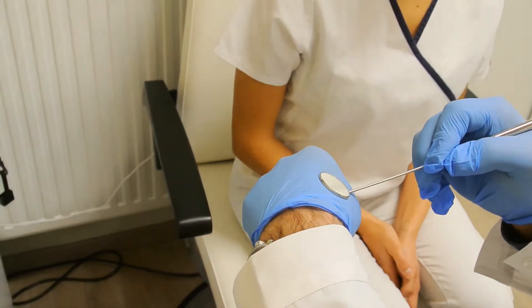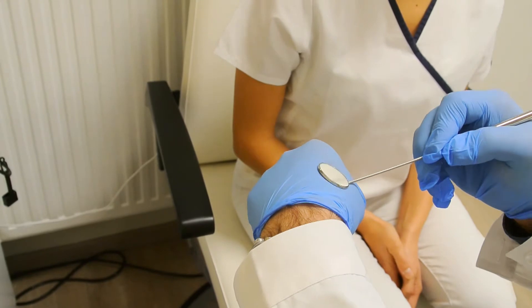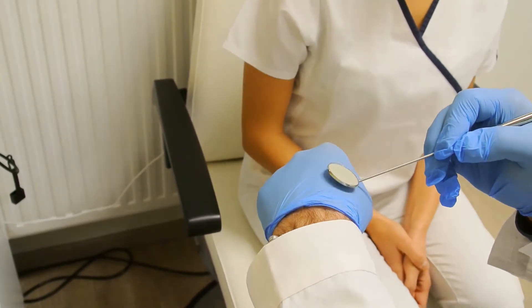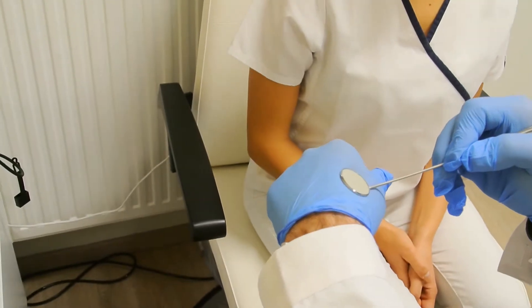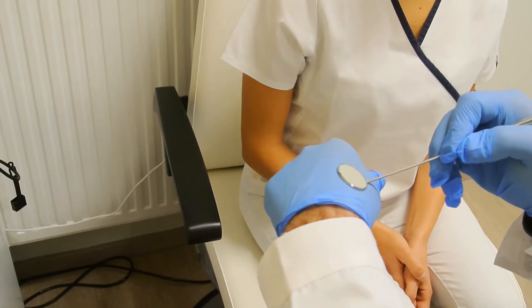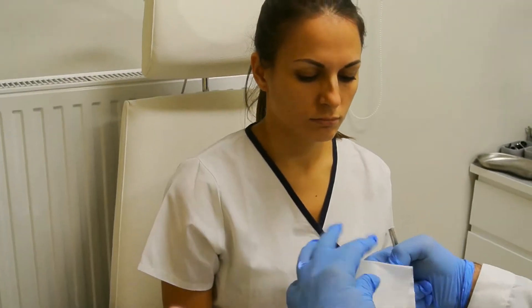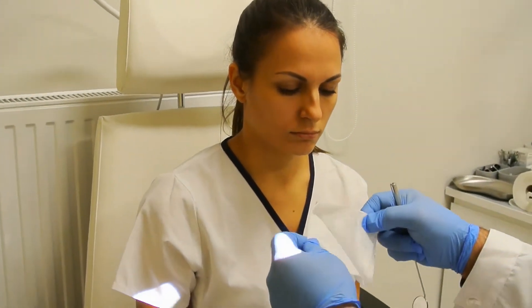It's good if the patient sees that you touch the heated mirror to your own skin. This is especially important in the case of children, so they can see that the temperature of the mirror is not hot — what you're going to introduce into the patient's mouth.